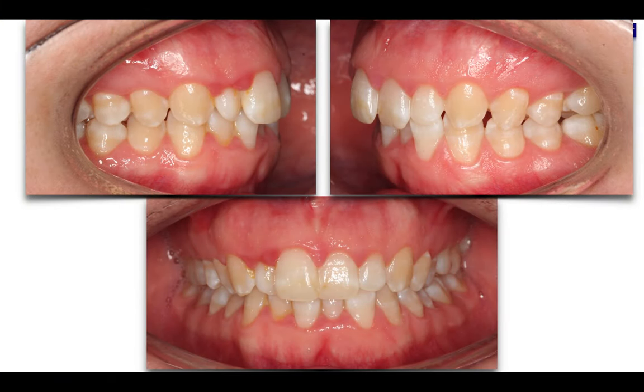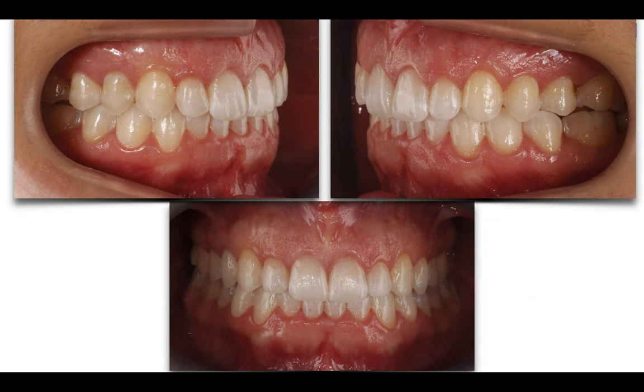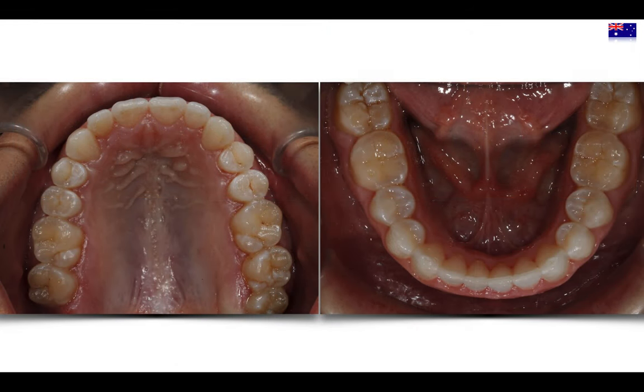We started with severe Class 2 in both sides. Something complex to control was the small lateral incisors — I'll explain in another lesson how to handle that. Moving from there, we got these amazing results in both arches, solving the occlusion and giving her the smile she was dreaming of. Look at the amazing change. This is what we can achieve with aligners, with the screws, following the protocols and common sense.